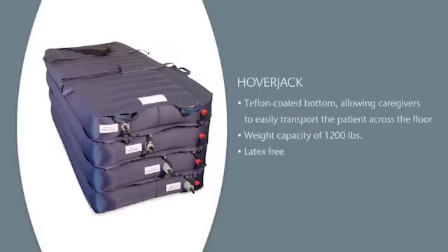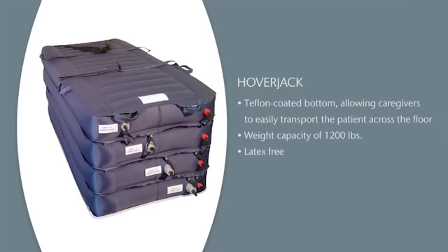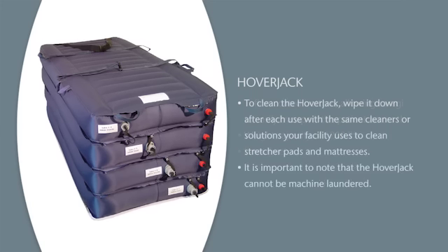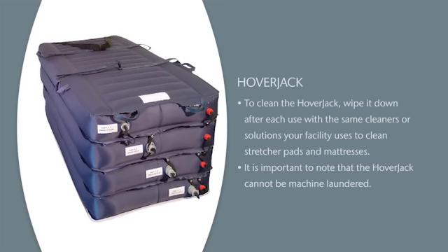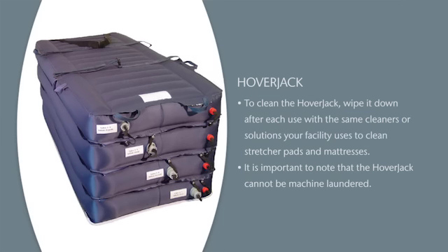The HoverJack has a Teflon-coated bottom, allowing caregivers to easily transport the patient across the floor. The HoverJack has a weight capacity of 1,200 pounds and is latex-free. To clean the HoverJack, wipe it down after each use with the same cleaners or solutions your facility uses to clean stretcher pads and mattresses. It is important to note that the HoverJack cannot be machine laundered.